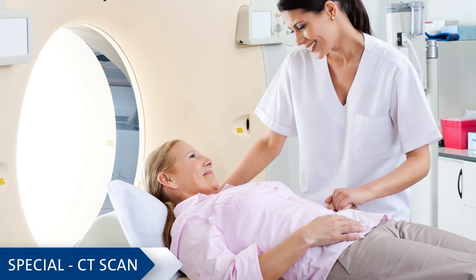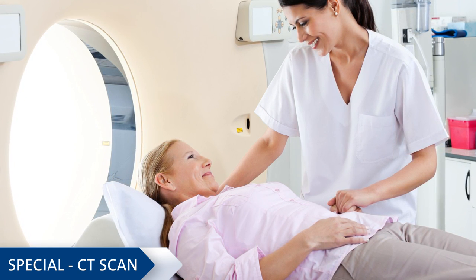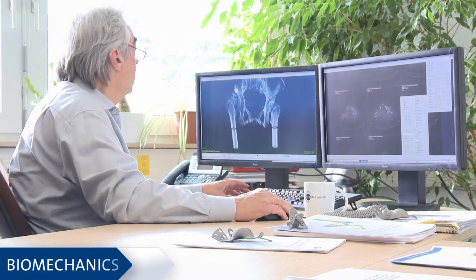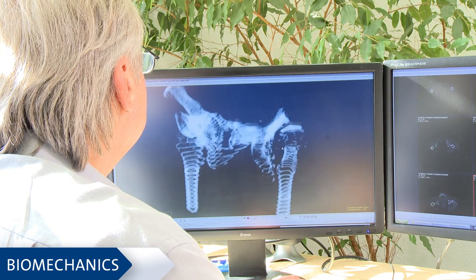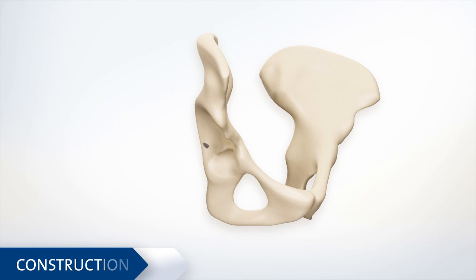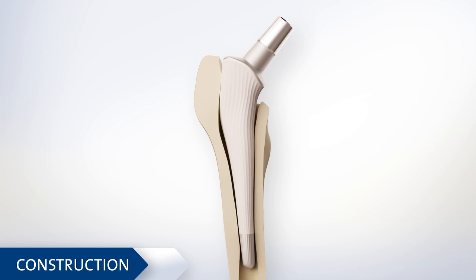At first, a precise computed tomography x-ray is taken of your skeleton, from the spine down to the feet. On the basis of these data, the axes are aligned in the best possible way by means of specific computer programs. The new prosthesis is designed precisely in accordance with the analyses. A simulation program secures optimal implantability of the implant.